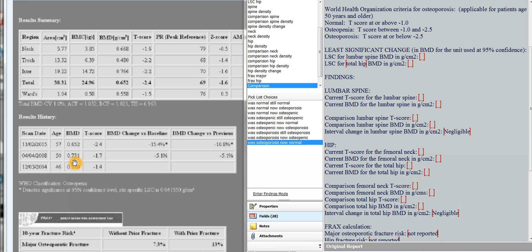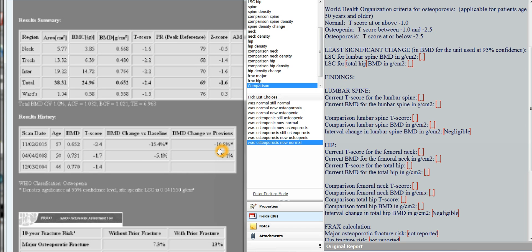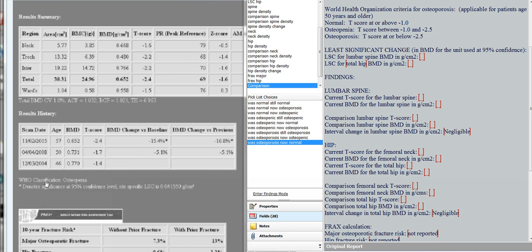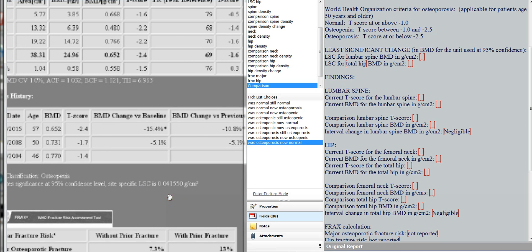This shows the bone mineral density column and it shows that over the interval from 2008 to 2015, there has been a bone mineral change of minus 10.8%. So there's been an 11% decrease in bone mineral density in the total hip. But let's see if that is a statistically significant change. So what you do is, under the results history table, you look for the least significant change required for the hip. And in this case, it's 0.041 grams per centimeter squared.